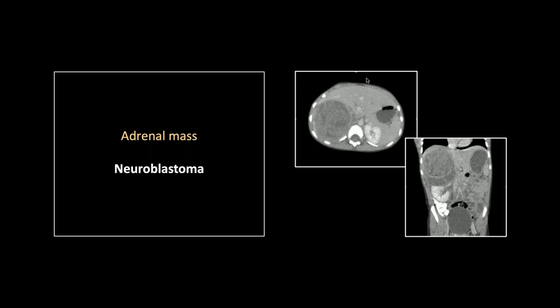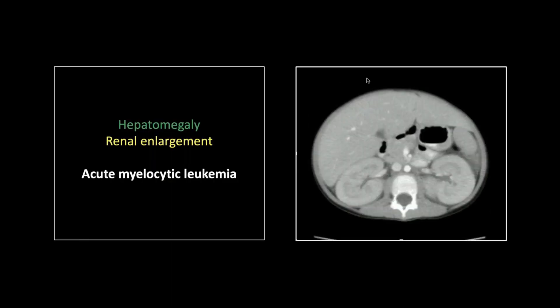Very good collection there of right upper quadrant tumors. One more pediatric case — this doesn't have to be a pediatric entity but this was a pediatric patient with acute myelocytic leukemia, AML. That's the one that can present with infiltration of different organs. I've seen this affect the lungs and the liver, and in this case the liver is enlarged, but the kidneys — look at these kidneys. The cortex is far too thick, the columns of Bertin are far too thick, and you can even see wisps of density within the pyramids suggesting infiltration.